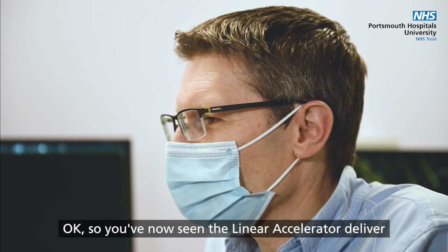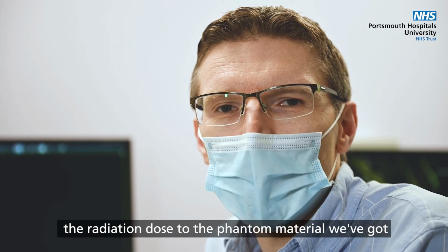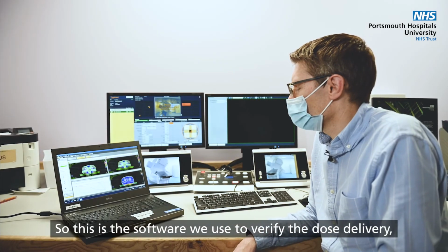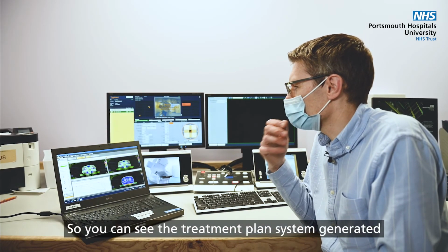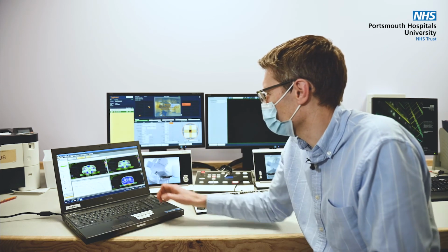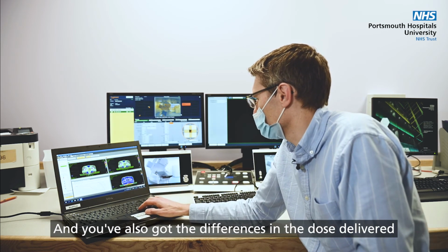Okay, so you've now seen the LINAC accelerator deliver the radiation dose to the phantom material we've got on the LINAC, so we can now look at the results. So this is the software we use to verify the dose delivery to the patient. You can see the treatment planning system generated dose here and then the actual measured dose here. And we've also got the differences in the dose delivered at the bottom there.